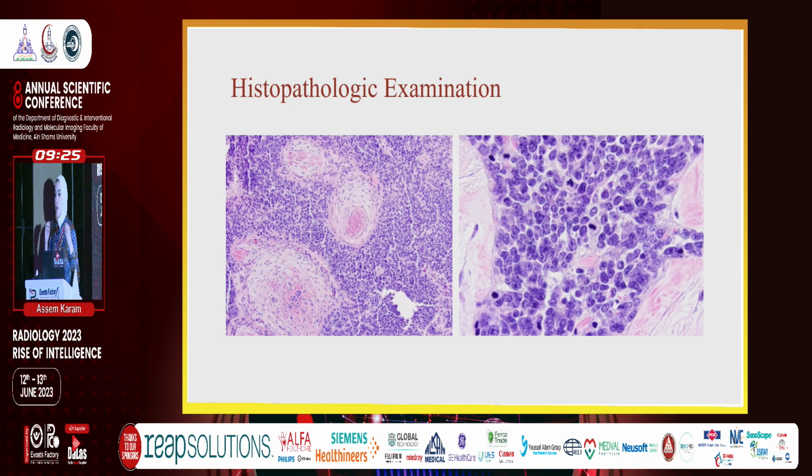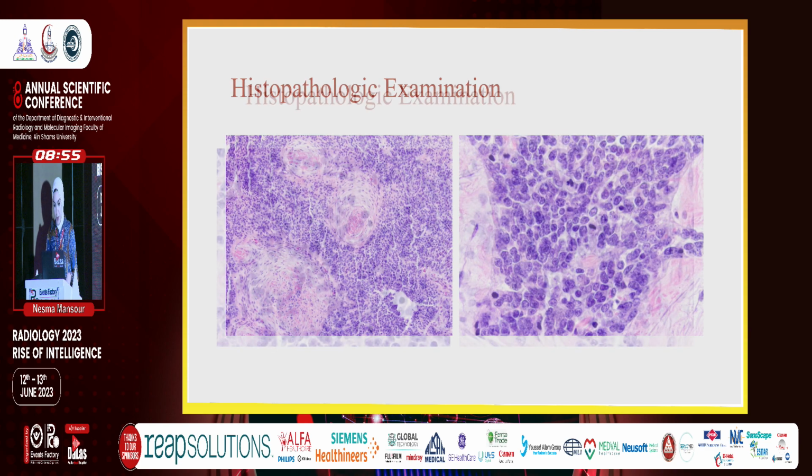We received the tissue as fragments, brain tissue pieces from a left frontoparietal lesion that was infiltrated or replaced by a neoplastic growth formed of sheets of cells which were hyperchromatic and pleomorphic. On a higher power, we can see these cells arranged around a central lumen or neuropil material.